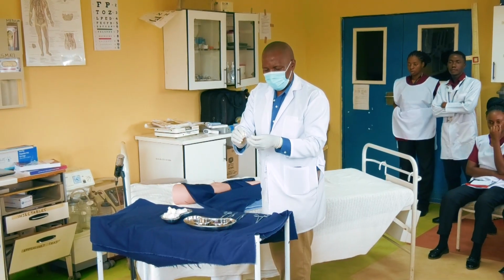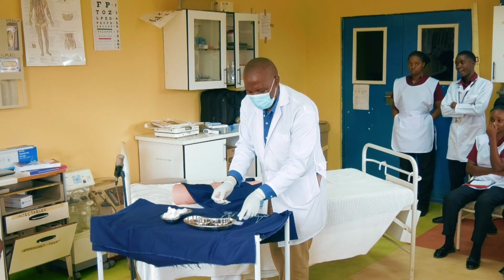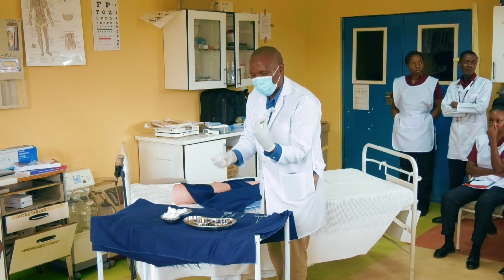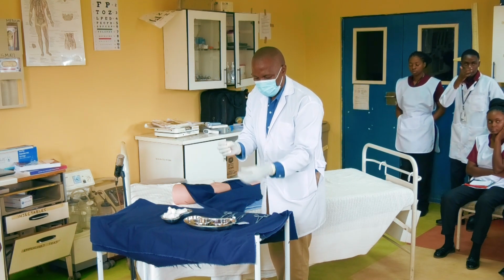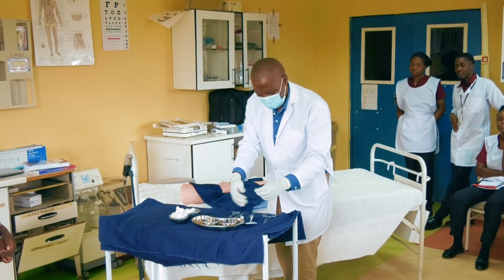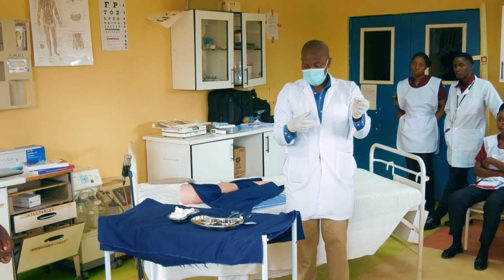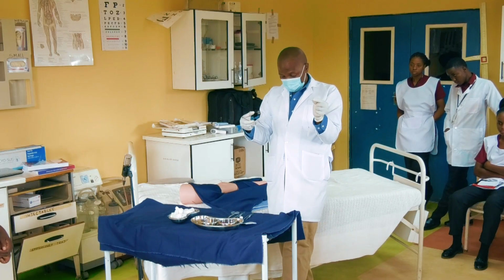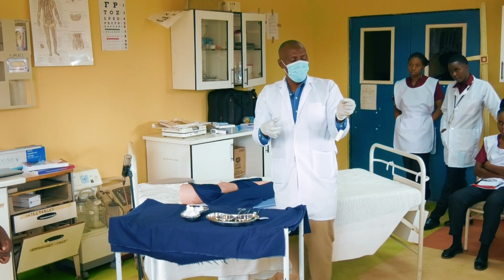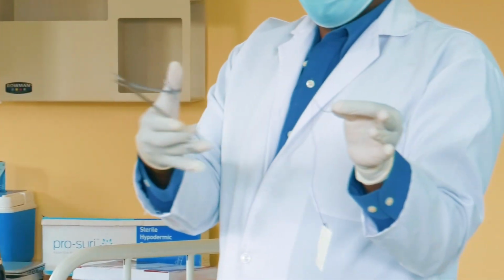Even this one, there is a little story that we need to understand. We are using Vicryl, unfortunately. Vicryl is for inner tissues. Just for the sake of demonstration, remember, ring finger, the thumb.